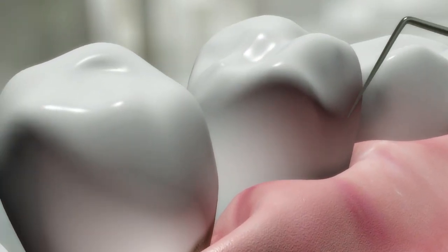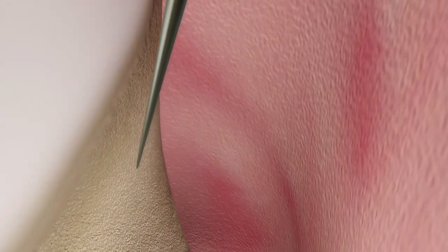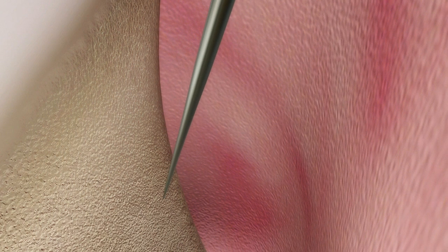Next, we use an endodontic explorer to confirm tactilely that all the calculus has been removed. If any calculus is remaining, the Erbium YAG laser is used to remove it.